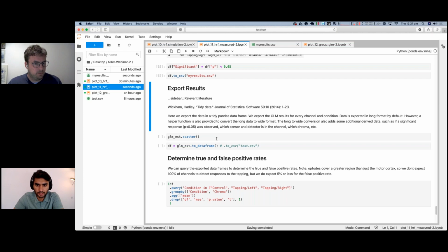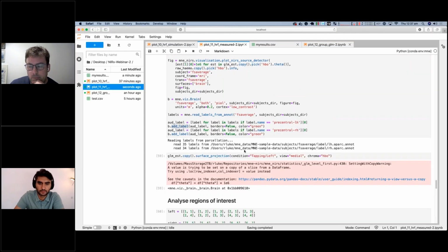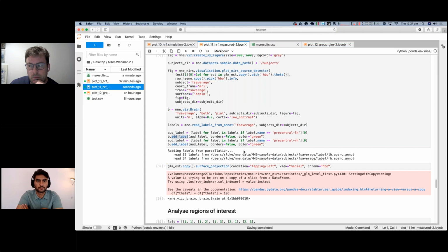And I'll start with the one on GLM. I think you covered this to some extent. Is it possible to use different GLM fitting paradigms like whitening of residuals or autoregressive models? And follow-up question on that is, how can we export the GLM data?